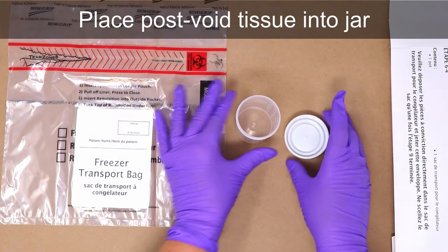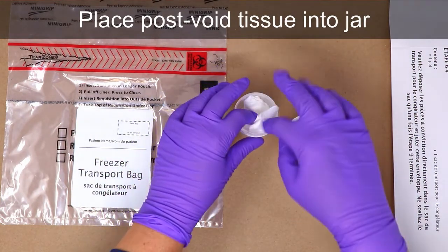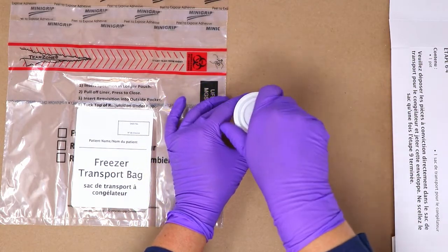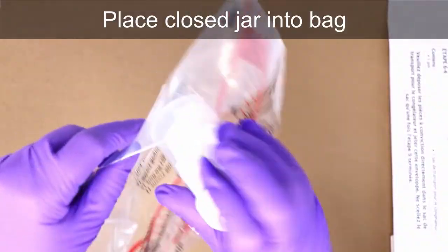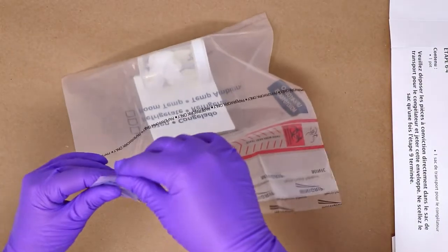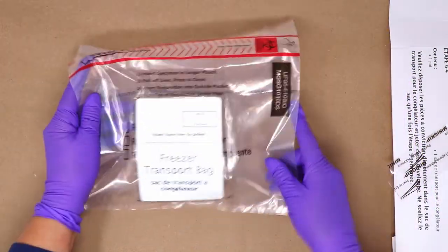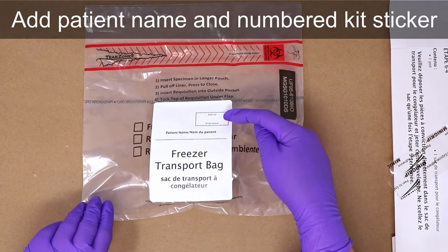In this case, we are collecting the post-void tissue. This is placed into the jar using clean gloves. Gloves should be changed at this stage before sealing the jar and placing the jar into the freezer transport bag. Do not seal the freezer transport bag until Step 9 is complete, as additional items may need to be added. Once Step 9 is complete, this bag can be sealed and placed into the freezer. The patient's name should be added to the bag, as well as a numbered kit sticker.